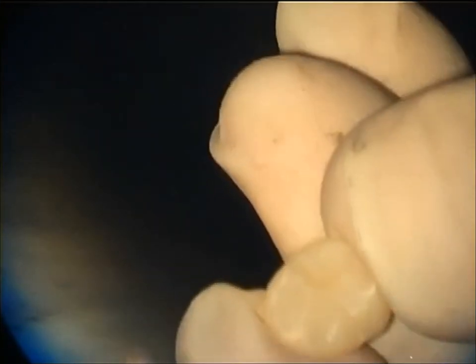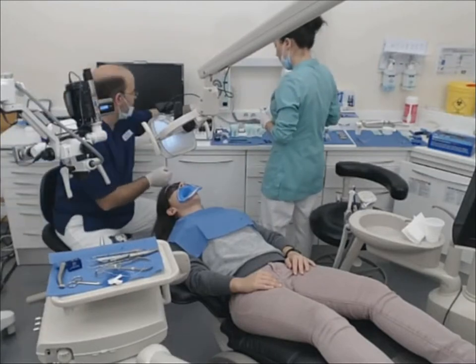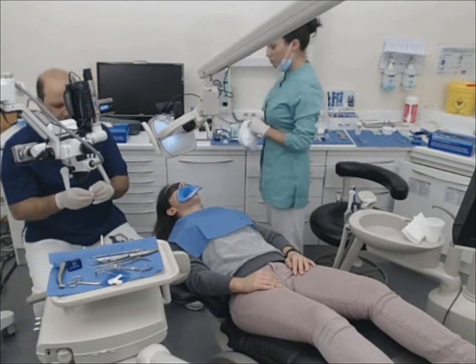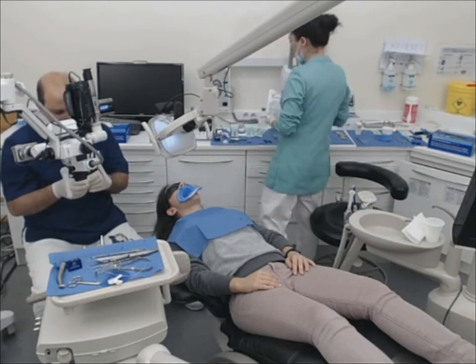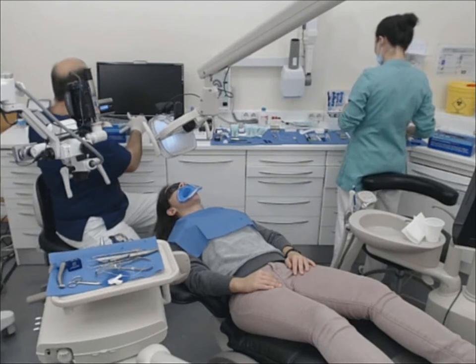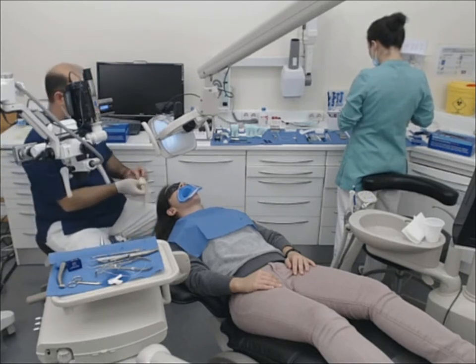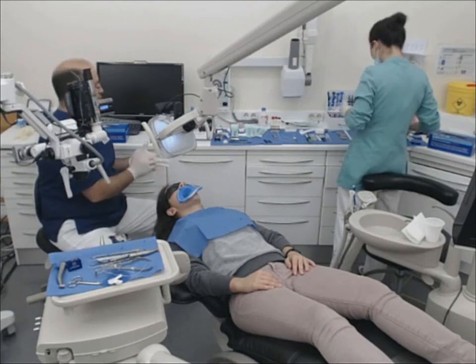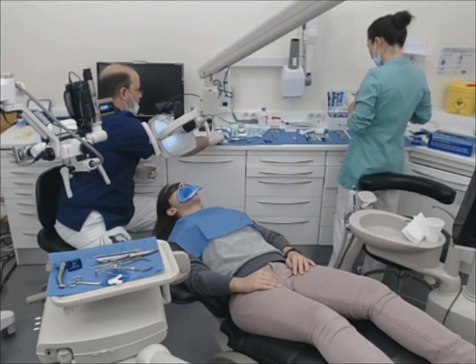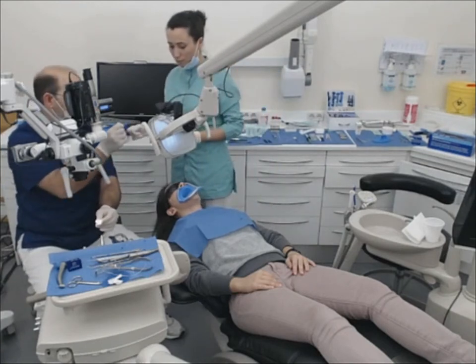So I remove a little bit of the shine in the middle, and now I'm gonna clean with alcohol. Okay, you can just wash with water, and also, if you want, you can put it in an ultrasonic bath. So I just clean. Just change my gloves, they're a little dirty from the polishing paste. And now I'm just gonna apply a little bit of adhesive, Scotchbond Universal. Okay, just a little bit.